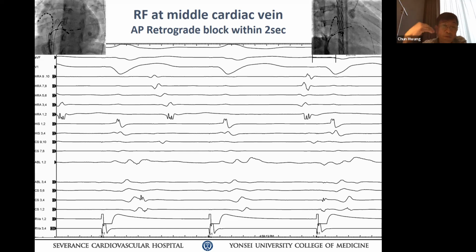근데 그 환자는 나한테 첫 번째가 아니고 Sunny한테 갔다가 ablation 했는데 myocardial infarction이 돼서 they aborted the case and this patient sent home. Unfortunately, patient from Utah. So she came to see me. We ablated it. 그런데 그 당시에 Sonny had to put acute stent on the posterolateral branch. 22-year young lady. 그래서 만약에 high power ablation 하시거나 특히 요즘 irrigation ablation 하실 적에 right posteroseptal pathway 중에 left posteroseptal pathway which involve middle cardiac vein, around you plan to burn, especially os, you want to do the coronary artery angiography.